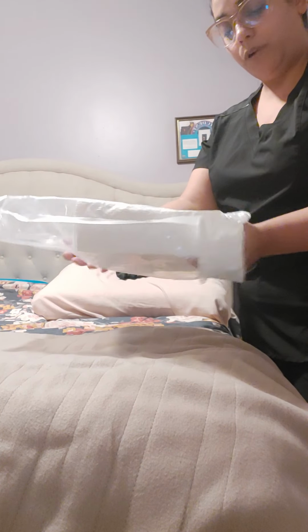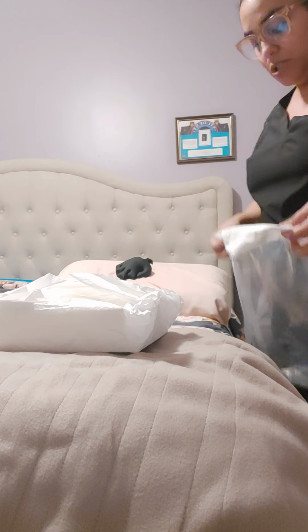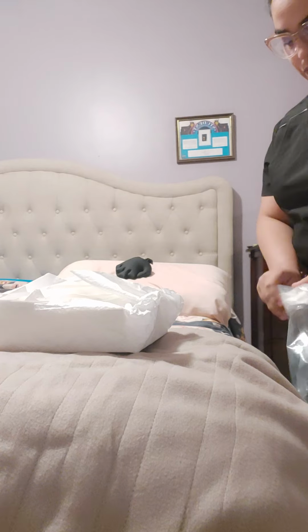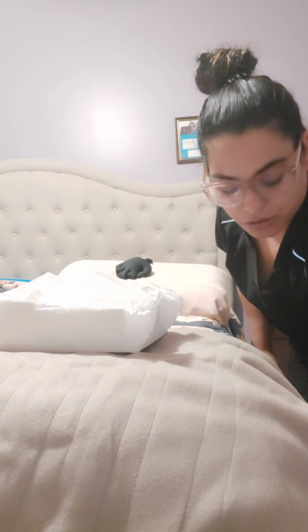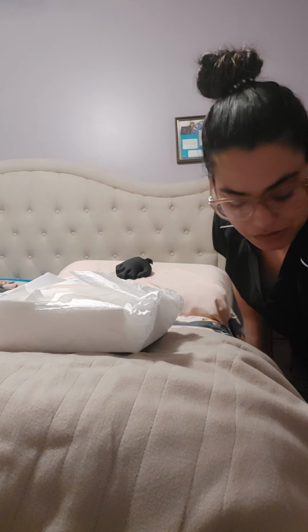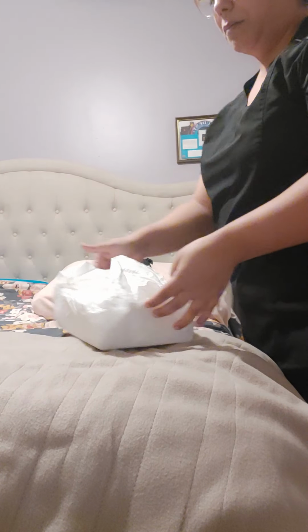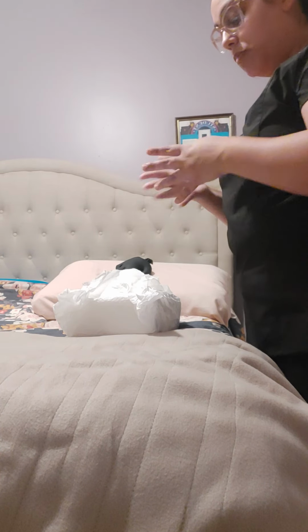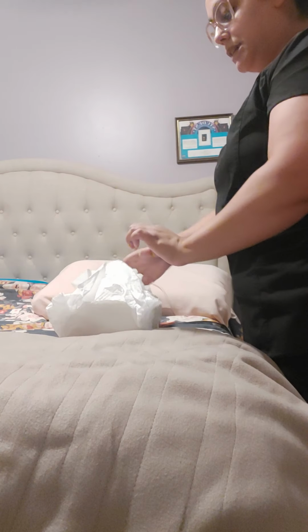Remove them from the kit. I can use this bag as a trash, so I'm just going to roll it up and put it down below me, or you can put it on the bed next to you in between the patient's legs. Then I would open my kit. This kit is sterile, so there is a particular way of opening it. So I would be opening it.